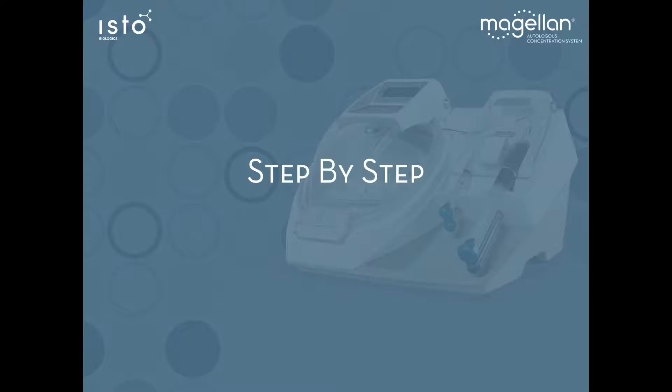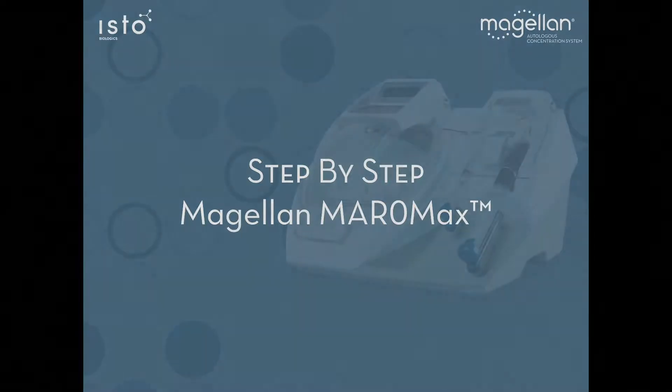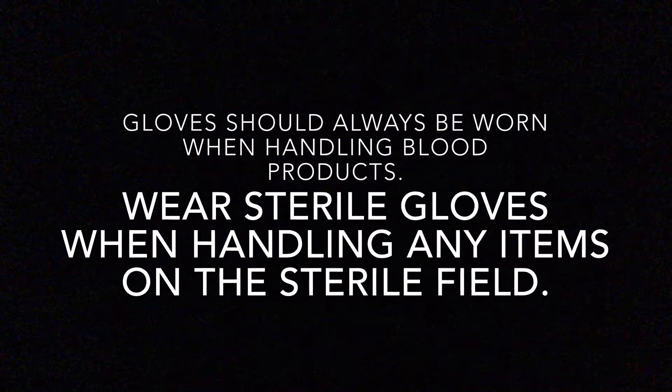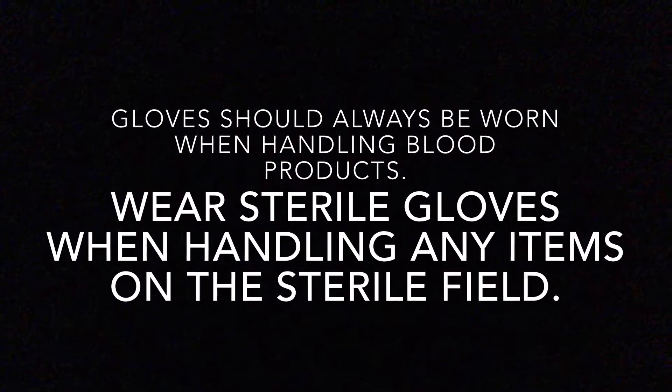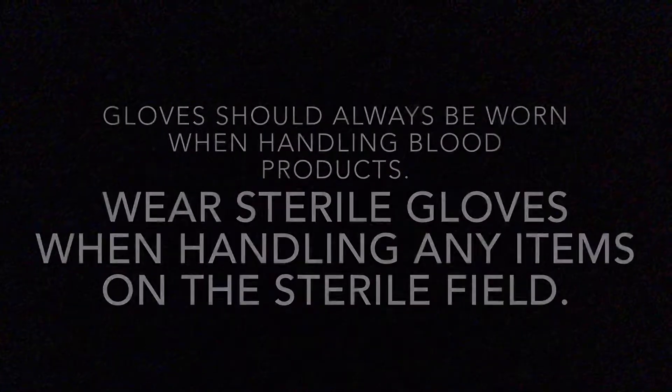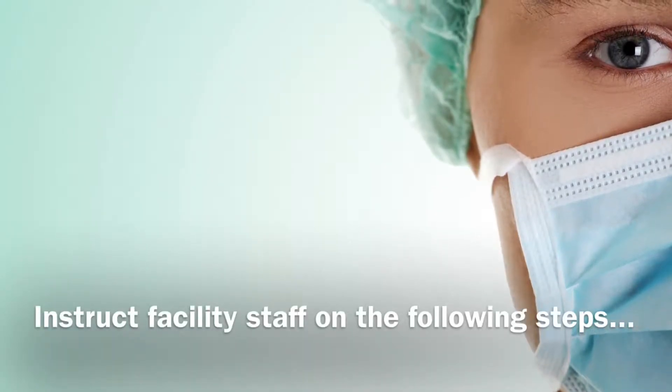This is a step-by-step guide for the Magellan Meromax kit. Gloves should always be worn when handling blood products. Wear sterile gloves when handling any items on the sterile field. Instruct facility staff on the following steps.